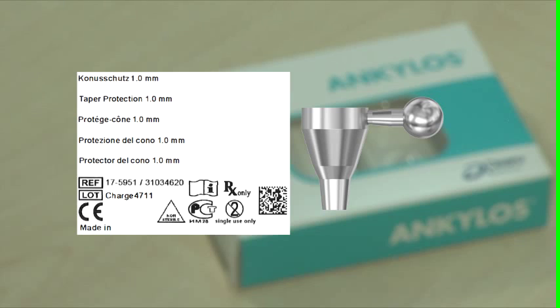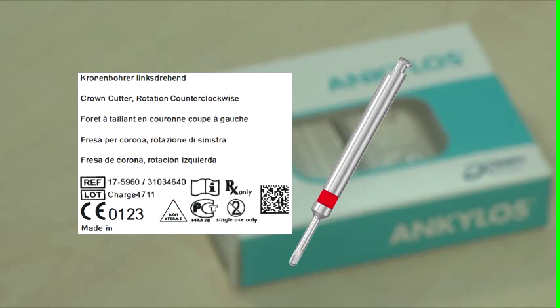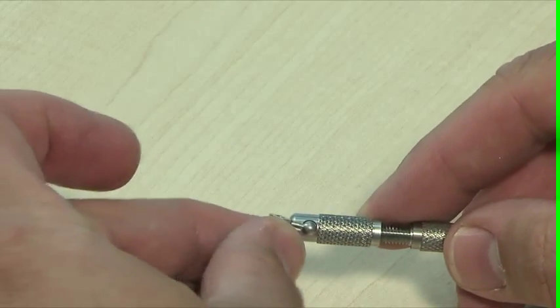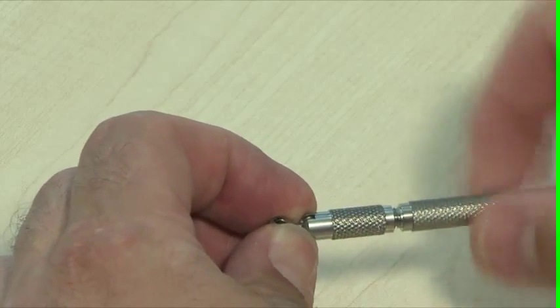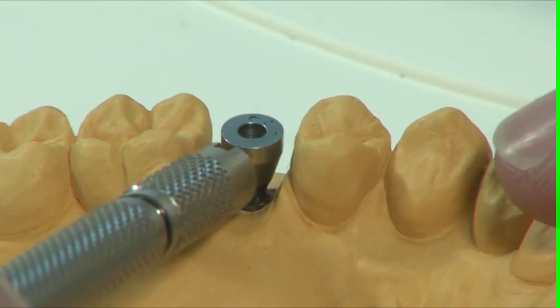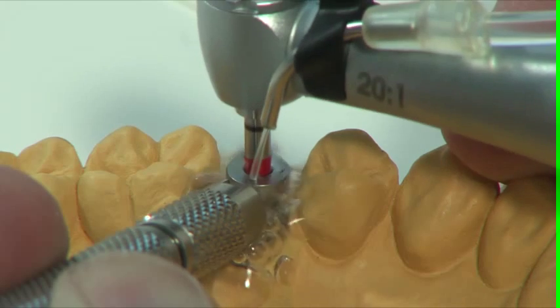If the methods described are not successful, the remaining screw must be drilled out. Position the taper protection 1.0 in the implant and ensure that it is securely in place. Drill in a counterclockwise direction up to the depth stop.